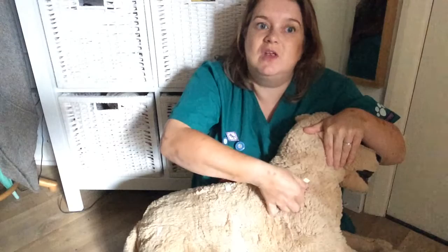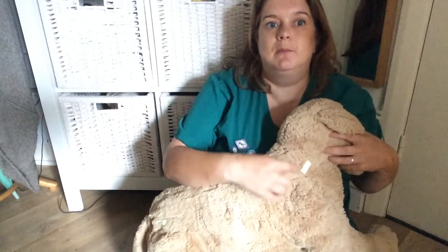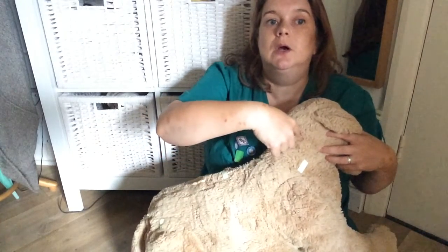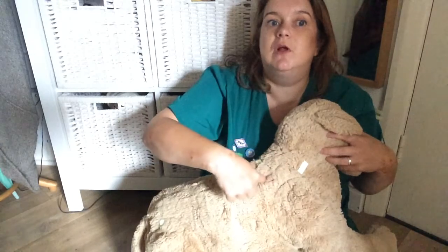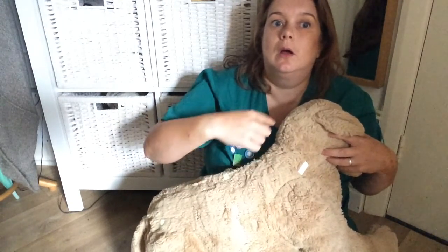You're going to end up with a slightly twisted patient compared to the beam, because you would want your line of interest — your cross-line — to go down here, and then you're going to form a square like that. I'll show you in the x-ray. That's how you would get your cervical spine image.